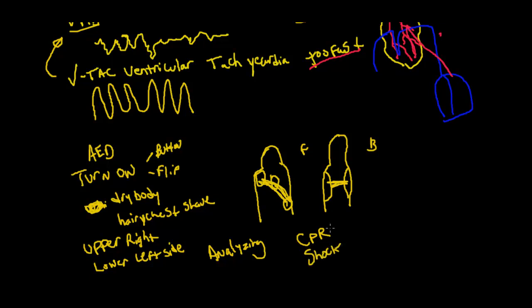It'll say shock advised. So let's go back through these steps. First, we turn it on. We prep the body. So we prep the victim. Place the pads. So we got pad placement there. It's going to say analyzing. We're going to say analyzing, stand clear. Make sure anybody with a cell phone is more than 6 feet away. This is common today. So the EMFs from the cell phone will interfere with its ability to analyze. Make sure they're not in a moving vehicle because it will also interfere.